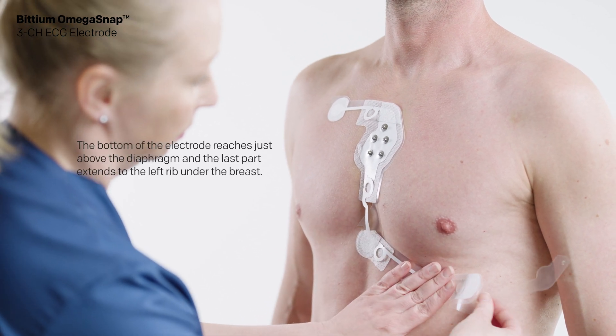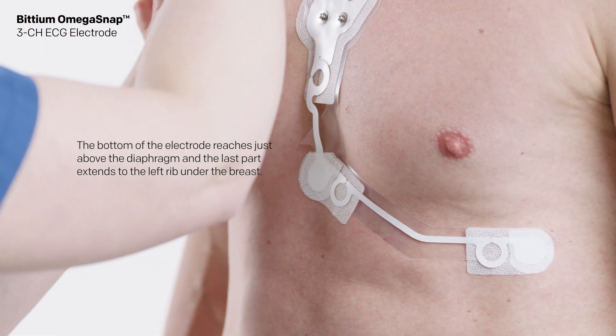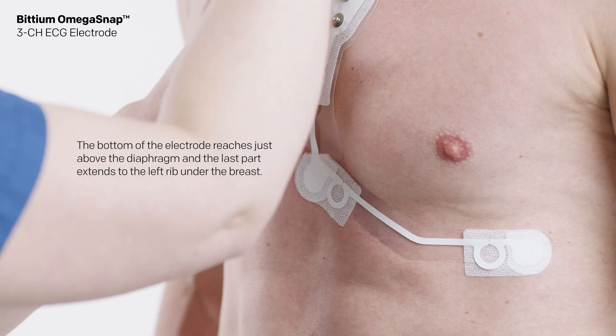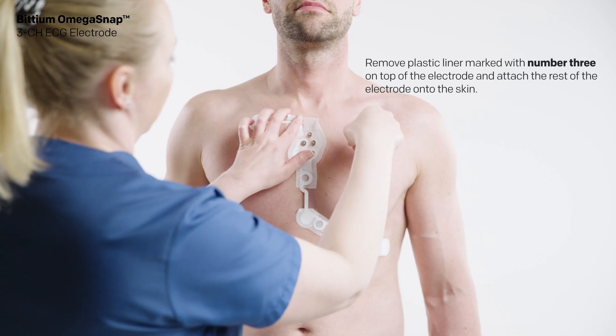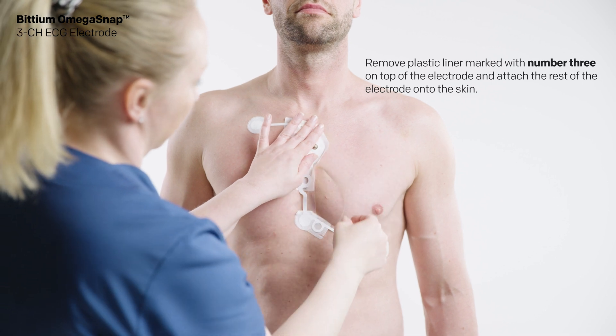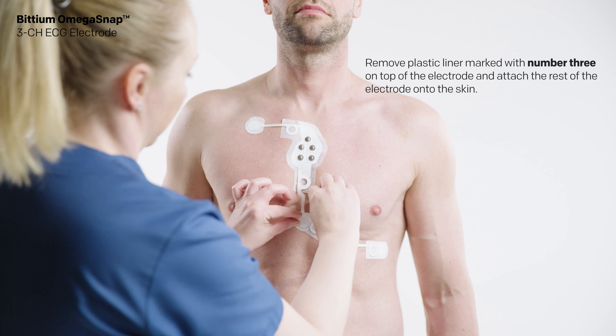The bottom of the electrode reaches just above the diaphragm and the last part extends to the left rib under the breast. Then remove the liner marked with number three on top of the electrode and attach the rest of the electrode onto the skin.